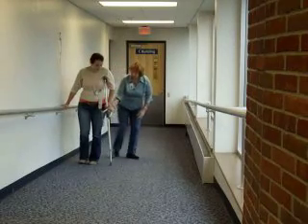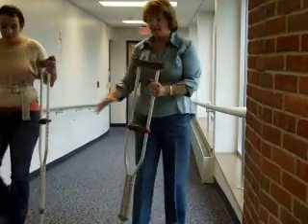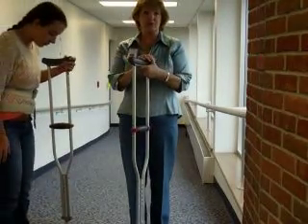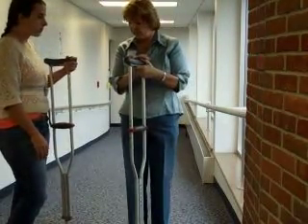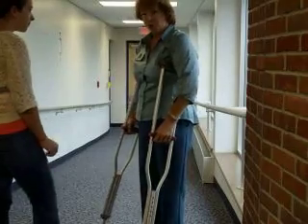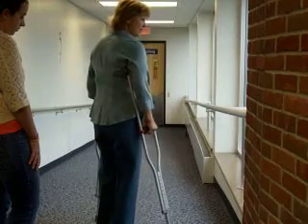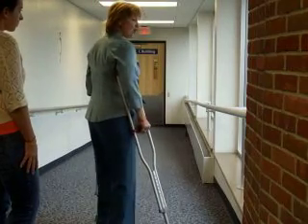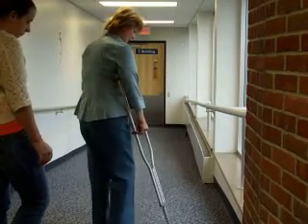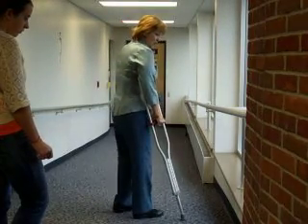We're going to go ahead and start at the top again. If she were a partial weight-bearing patient — we're going to keep using that right leg to be consistent — she's now using the three-point gait, also known as the protected extremity gait pattern. This time when she goes down, she wants to angle down with her strong side. If this is her sore foot and she's doing partial weight-bearing, she's going to angle this way because if she gets momentum going, she can stop herself with that strong leg. So the crutches are going to be angled, then her body is angled, and then it's weak foot, strong foot — crutches, weak foot, strong foot, and then she goes down.